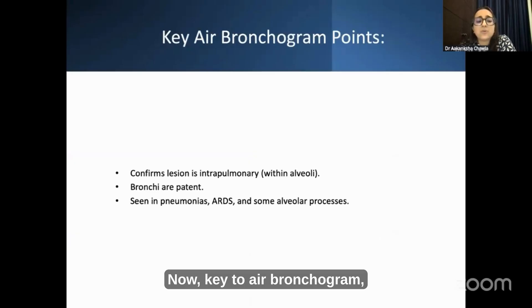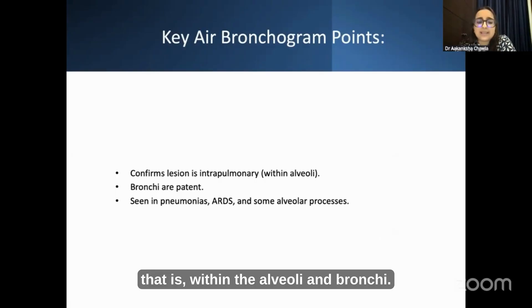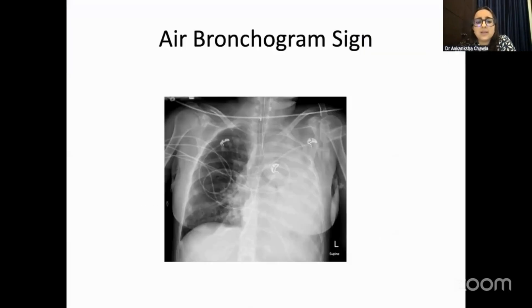The key to air bronchograms: it confirms the lesion is intrapulmonary, meaning within the alveoli, and the bronchi are usually patent. Seen in diseases like pneumonia and ARDS and other alveolar processes as well.